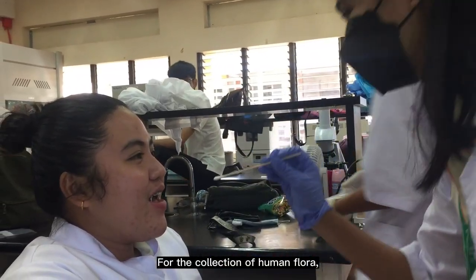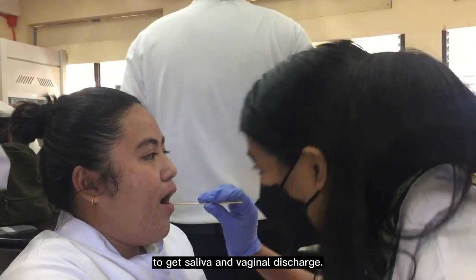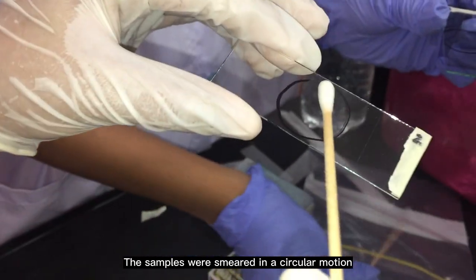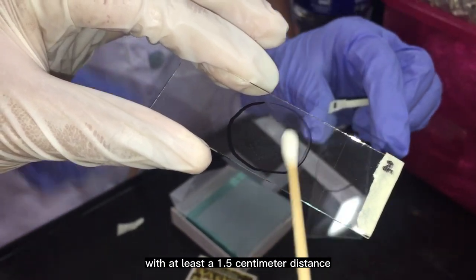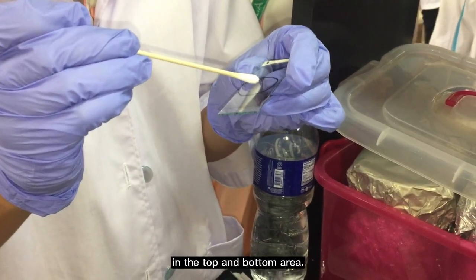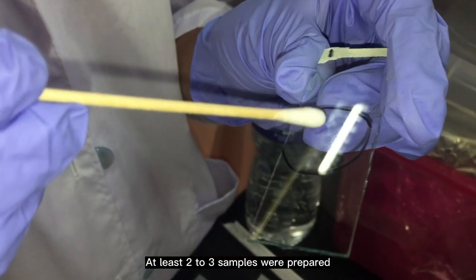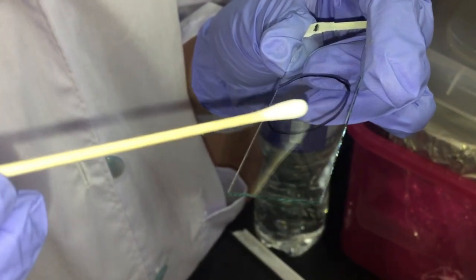For the collection of human flora, sterile swabs were used to get saliva and vaginal discharge. The samples were smeared in a circular motion as thin as possible with at least a 1.5 cm distance in the top and bottom area. At least 2 to 3 samples were prepared, and the slides were labeled using a paper tape.